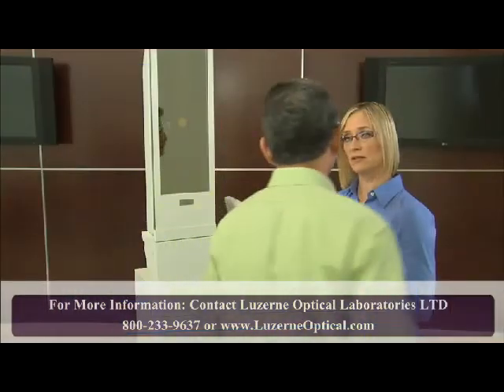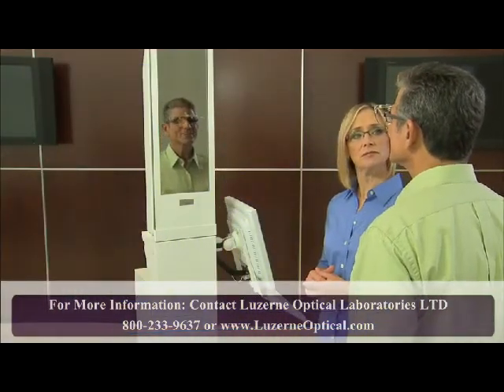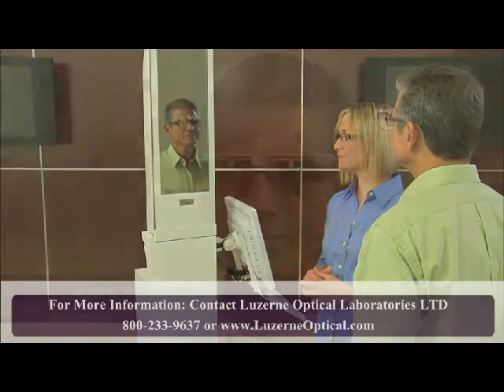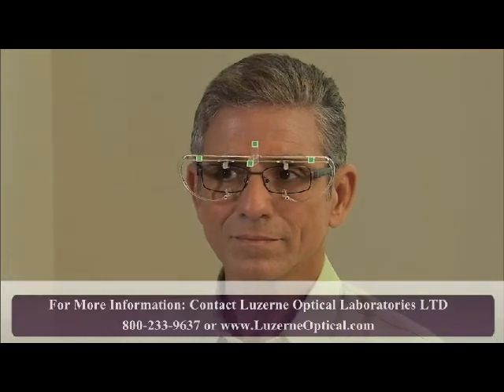Place the patient, wearing his or her pre-adjusted frames with the clip, in front of the mirror. The patient must be measured with the frames he or she will be using. For multiple pair sales, make sure to measure the patient in all frames selected.